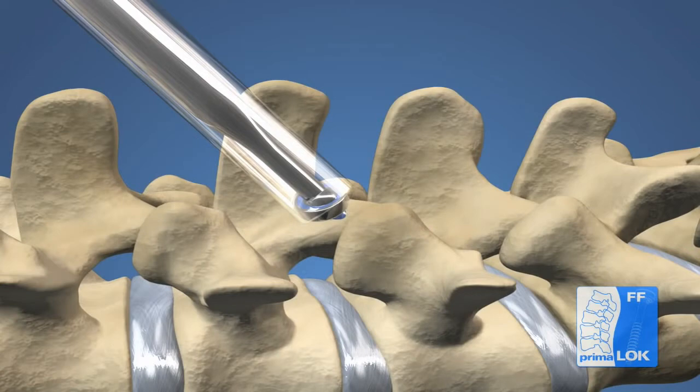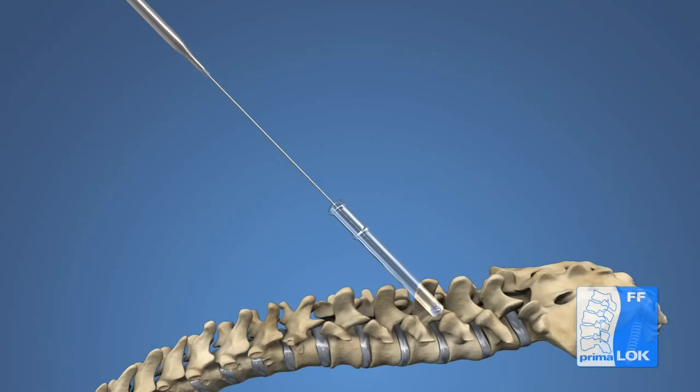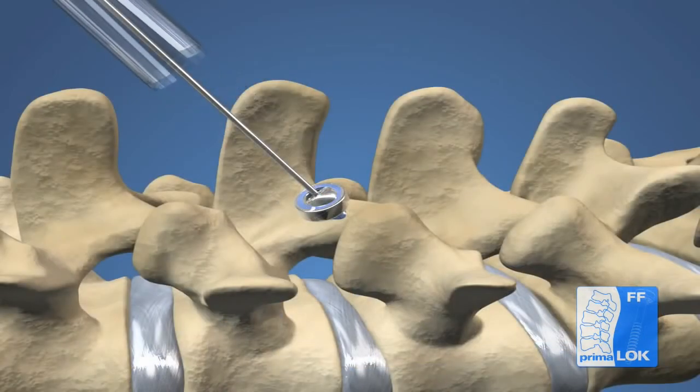Once screw placement has been confirmed, the screwdriver can be disengaged from the implant. Turn the knob on the proximal end of the screwdriver counterclockwise to unthread the inner retention shaft from the screw.